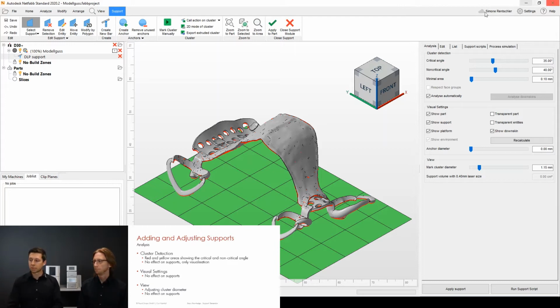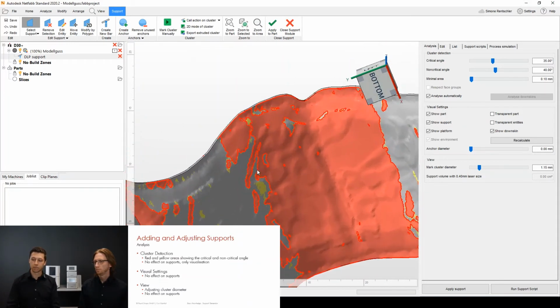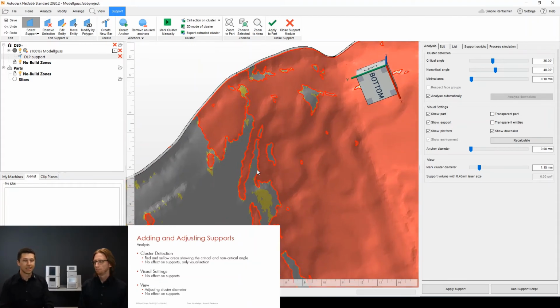So if we set this one up, what we will see underneath the part is red and yellow areas, and these are just showing the critical, the non-critical, this is the gray one, and the yellow, the area between the critical and non-critical. So just a visualization of what you have set in there.